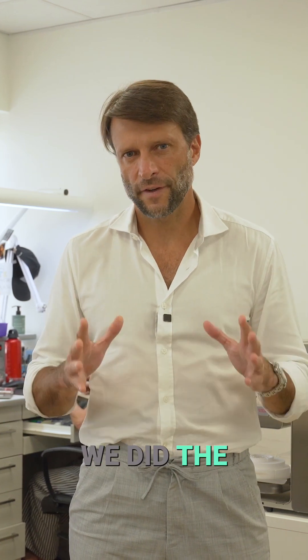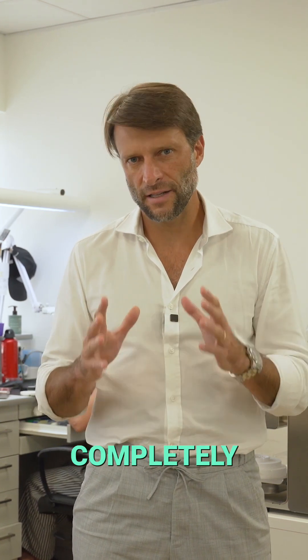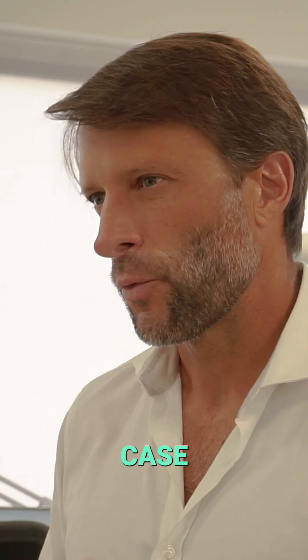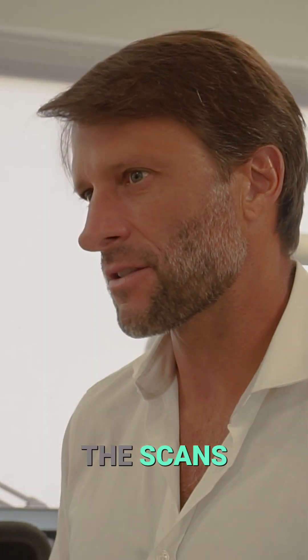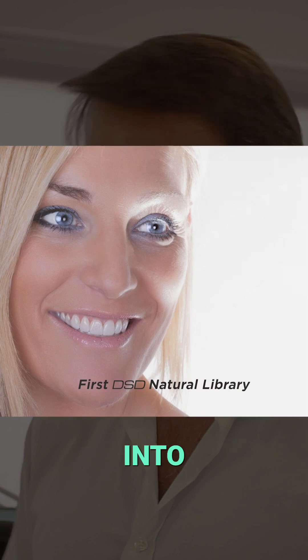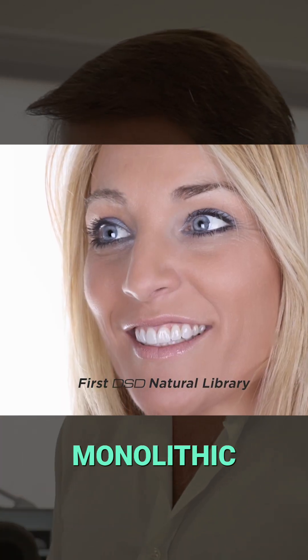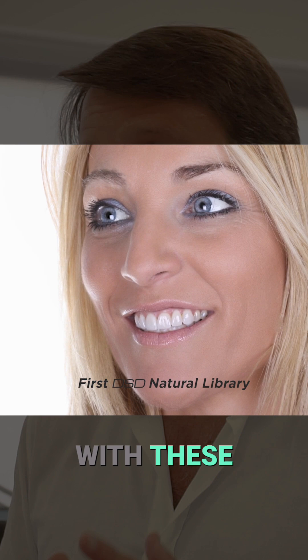Twelve years ago, we did the first ever completely digital Natural Libraries restorative case. We incorporated the scans of natural dentition into our CAD softwares, and we designed monolithic restorations with these natural libraries.